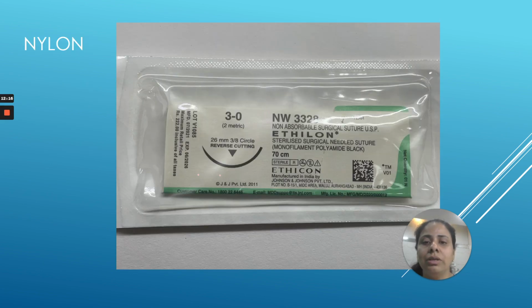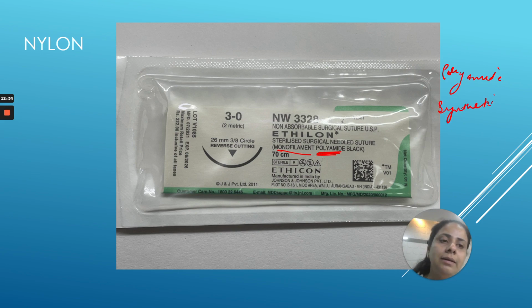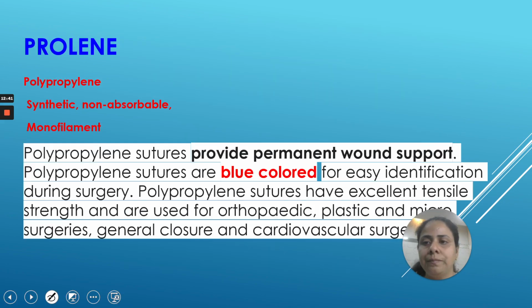So this is how the nylon suture looks like. I'm going to explain all these features. You can see these are monofilament polyamide. So nylon is polyamide, synthetic. Here the picture is monofilament. Mostly monofilaments are used.